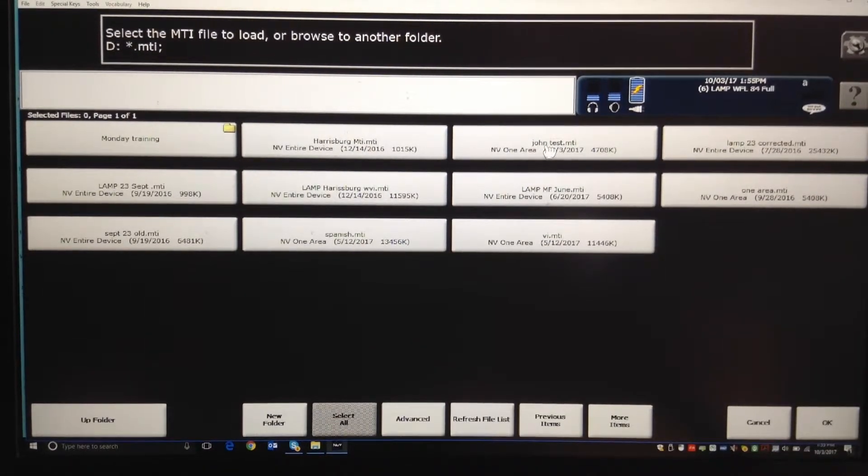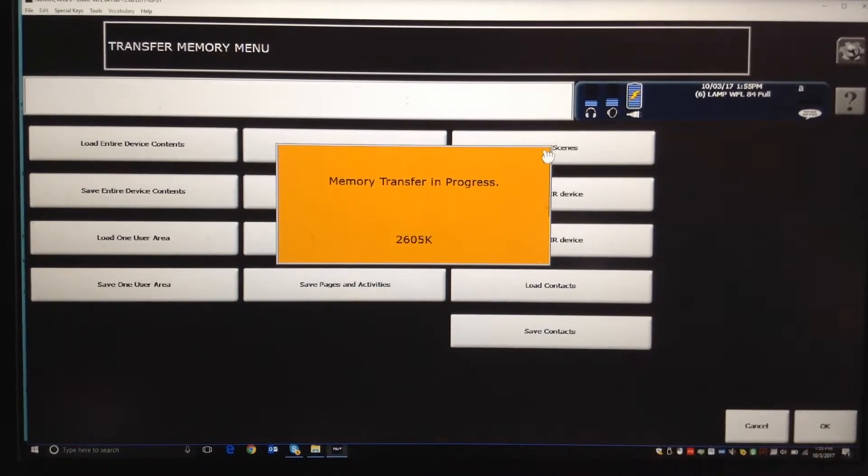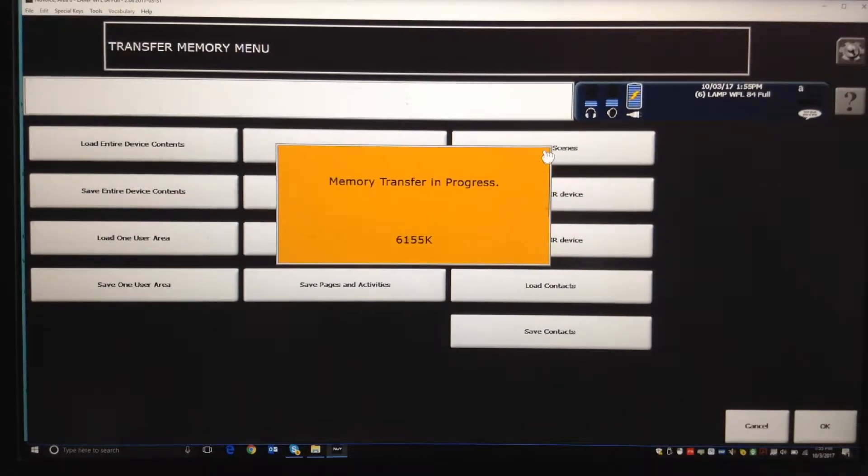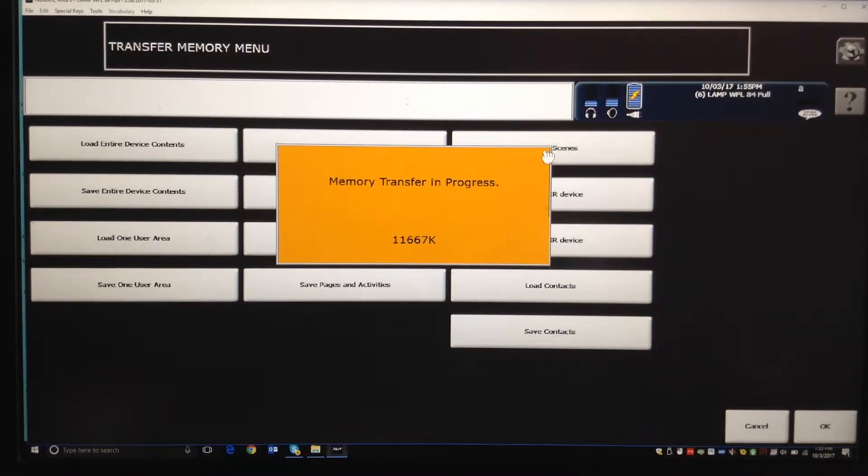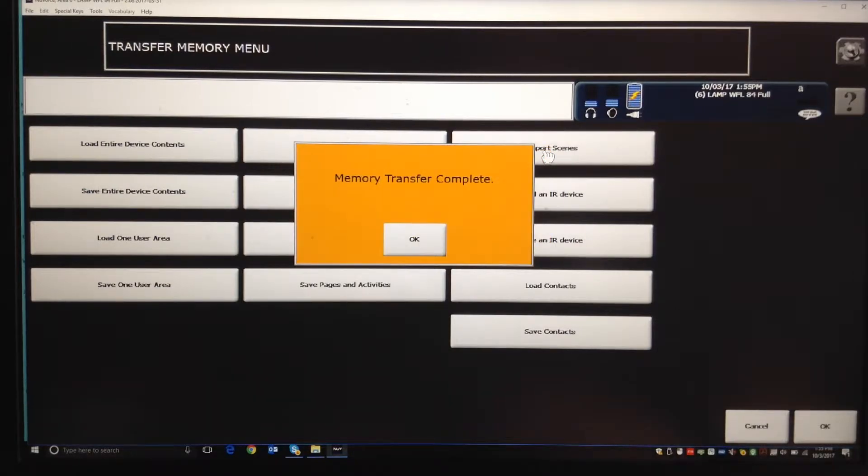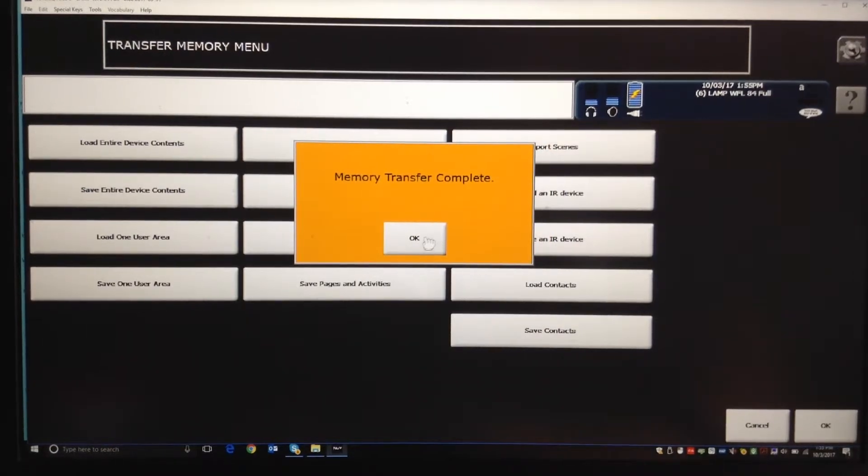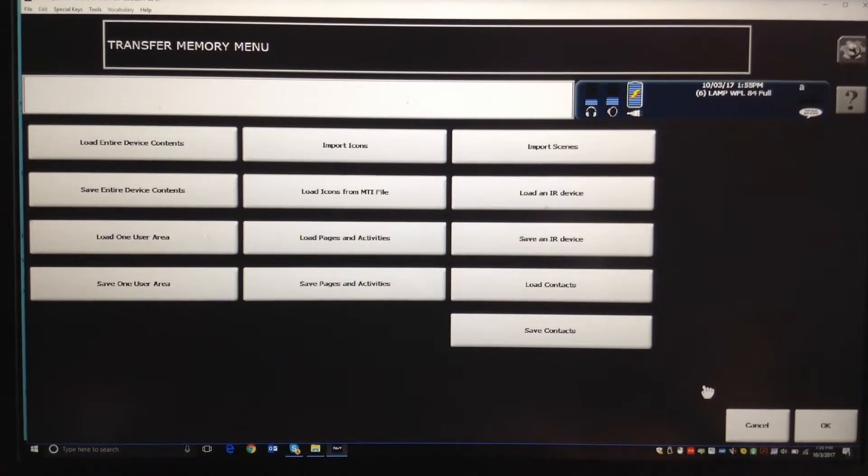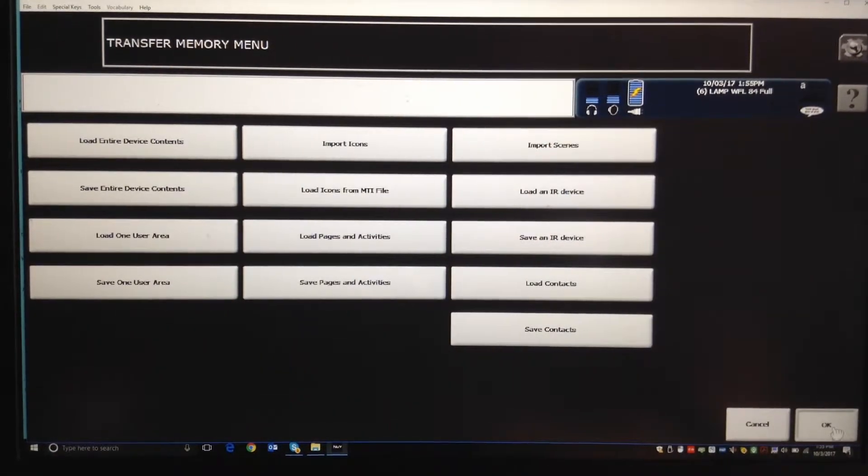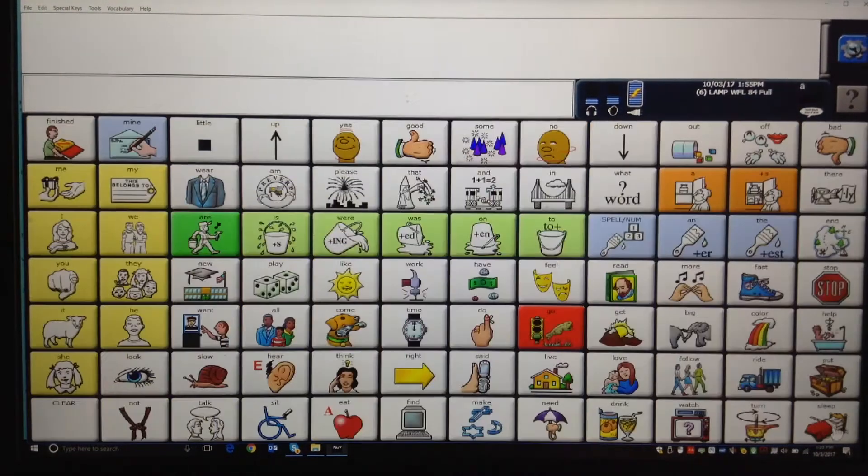And when I touch that, it takes it from that jump drive and puts it onto my PaaS software, and now I've got a copy of my child or the individual I work with's device.